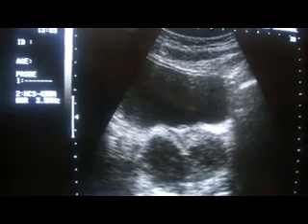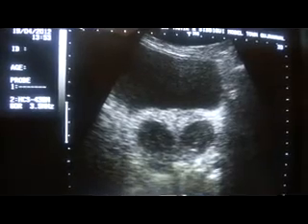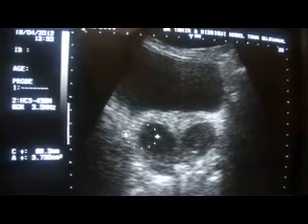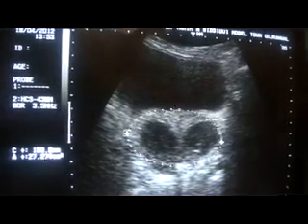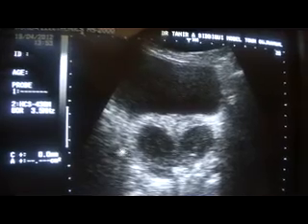So measuring in any direction, the right measures 25 into 28, the left measures 25 into 28, the right measures 26 into 28 millimeters. Now, all of this is the prostate gland in transverse section.